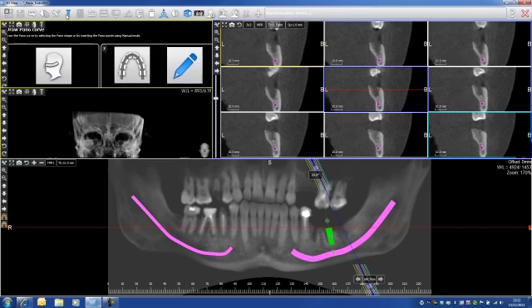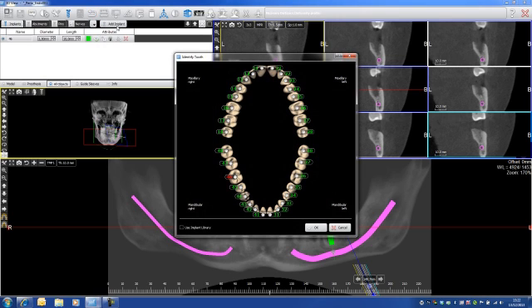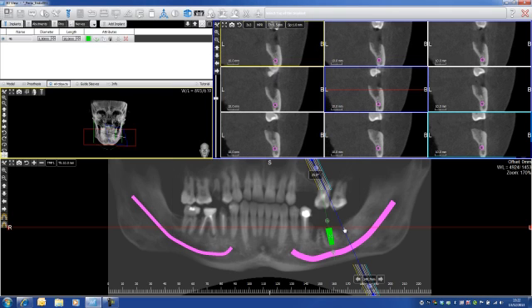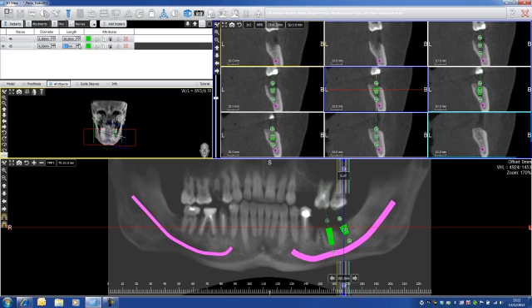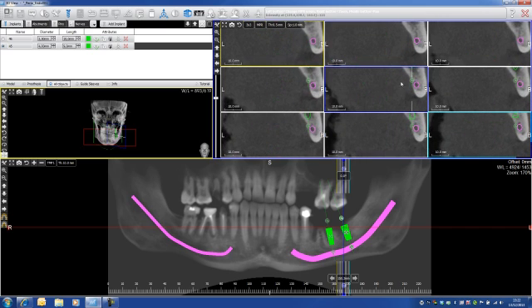I can go here again, add implants, select the tooth that I want. Then first left click — I angulate again, and then I increase the length: let's say 7, 8, 9 millimeters. I have to be careful not to touch the mandibular canal here. I can re-angulate my implant, and of course I can see it on my cross-section.